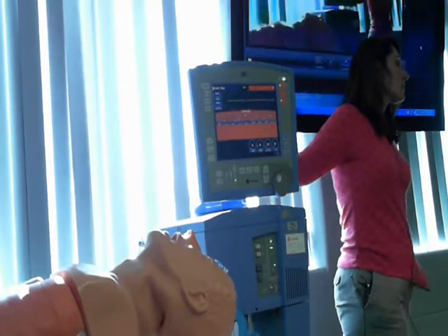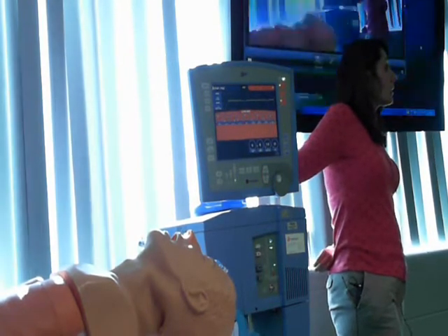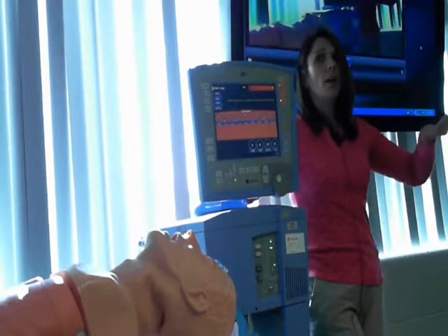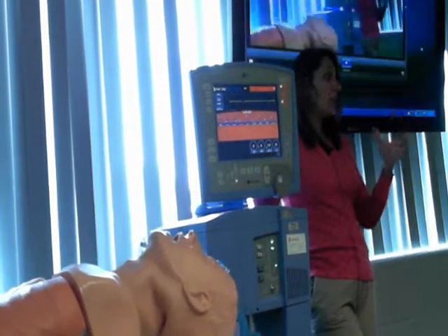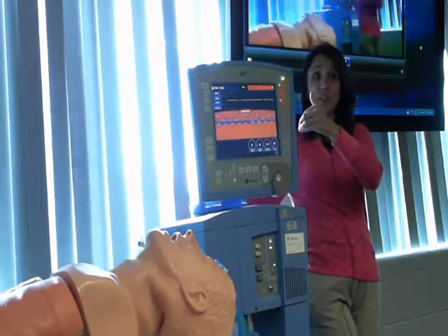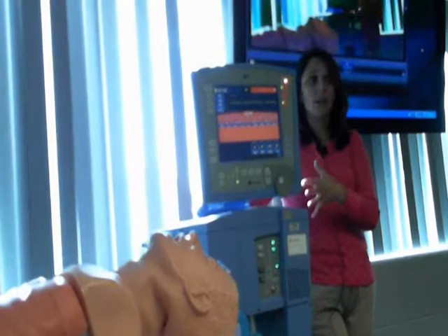So if we have them in the SIMV and we're going to give them a high dose of a narcotic, do you then switch them to the AC, or do you wait to see if the backup will? That's a very good question. Could those of you on the other side of the room hear her question? Okay. Her question was, and I'm going to try to paraphrase, correct me if I'm wrong, that if you have a patient who is in SIMV and they need the high dose of narcotic, which could knock out their respiratory drive, and you know you need to give it, do you need to switch them back to assist control, or do you depend on the backup ventilation through apnea to take care of it?